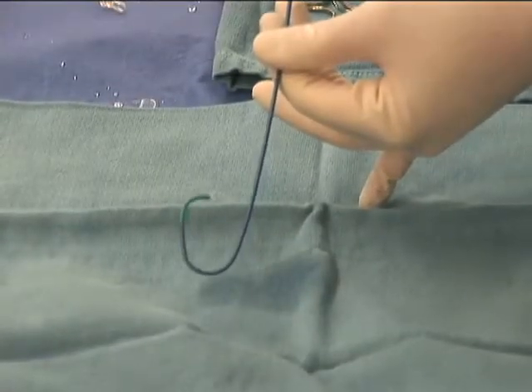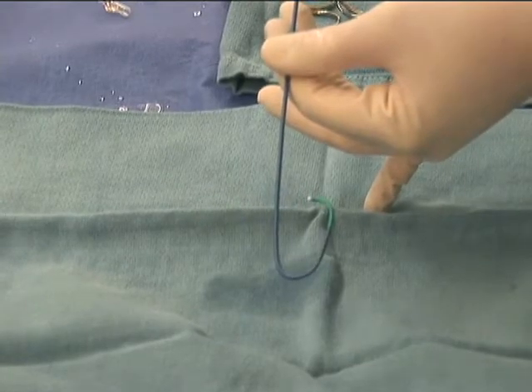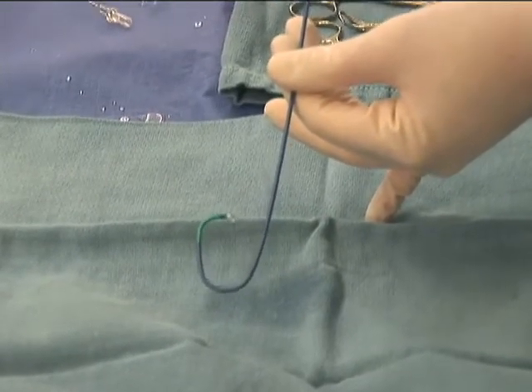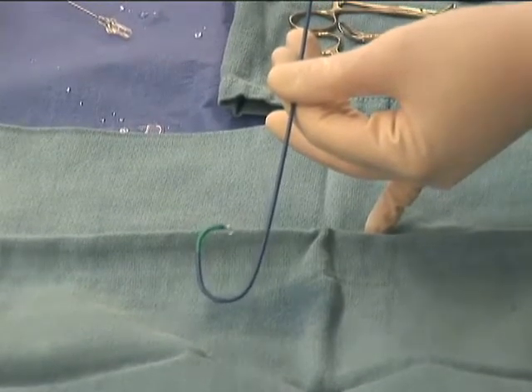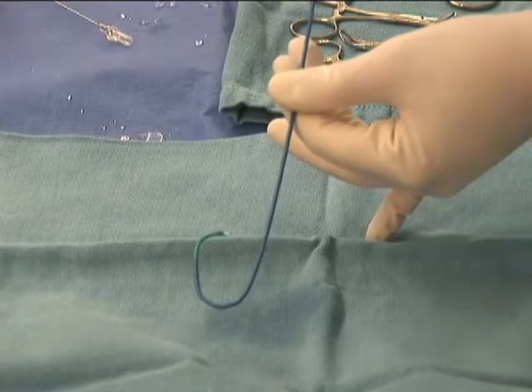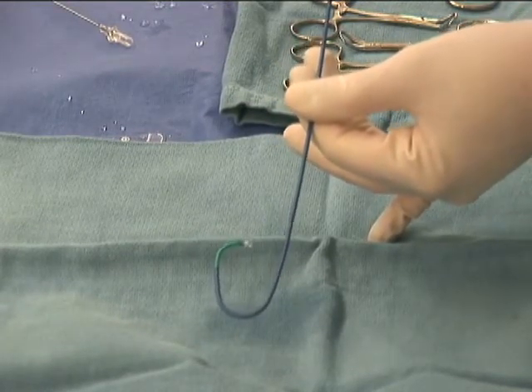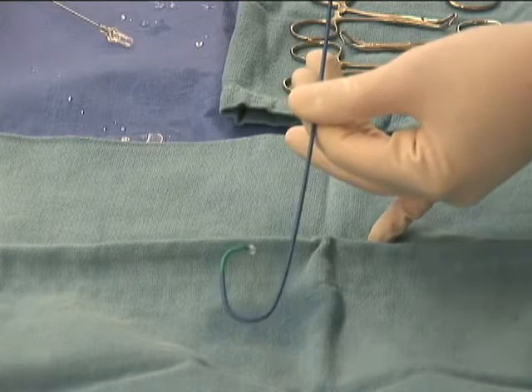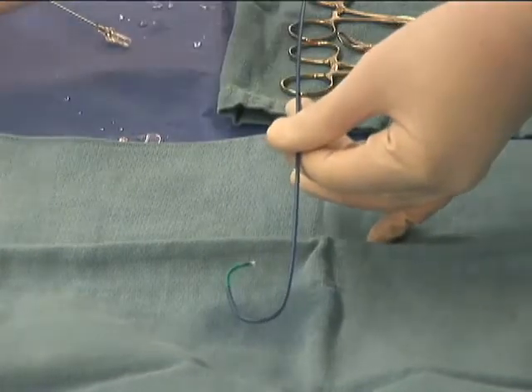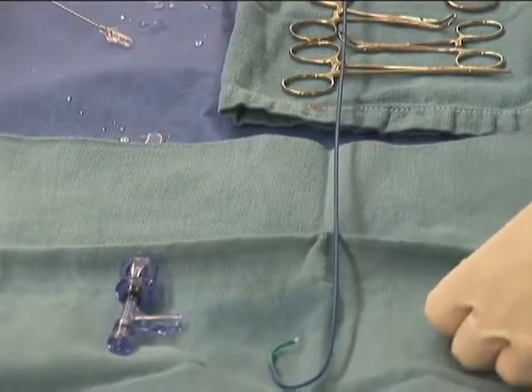In this example, a 6 French JL4 guiding catheter will be used to cannulate the left coronary artery in preparation for FFR. Various anatomic factors such as lesion location and tortuosity play critical roles in the choice of guide catheter curves. Also seen here is a copilot hemostatic adapter, through which interventional equipment such as wires and balloon catheters are advanced into the coronary artery.